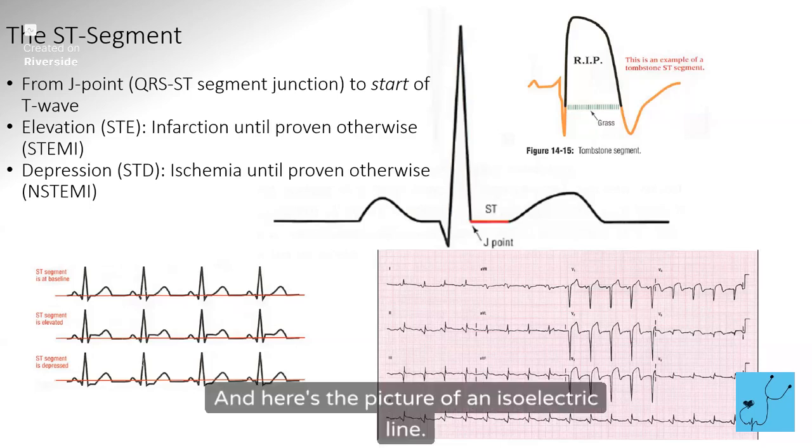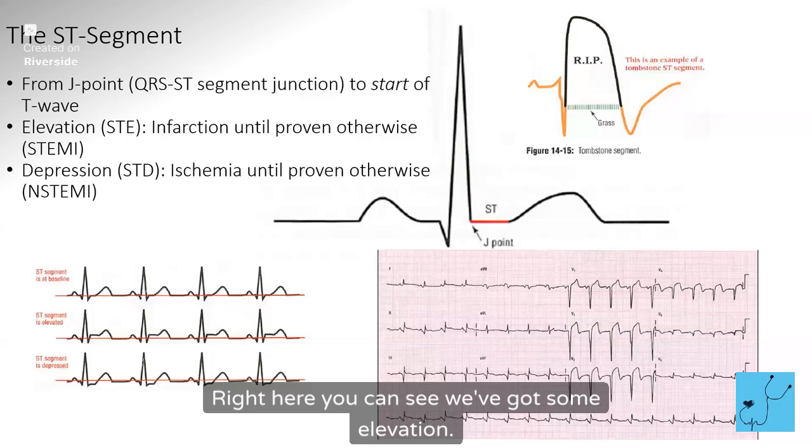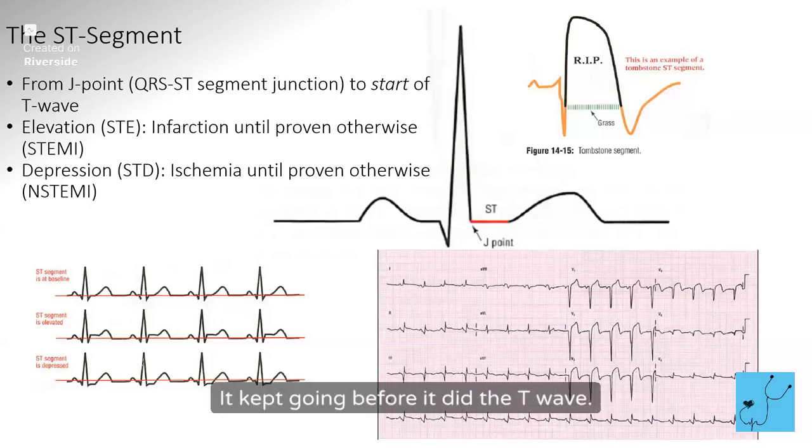And here's the picture of an isoelectric line, and you can see the QRS comes back to the line, and then it goes a little, and then the T goes off the line again, right? Here you can see we've got some elevation. It didn't come back, it kept going before it did the T wave. Here we have some depression.